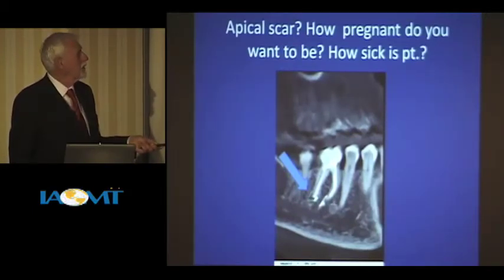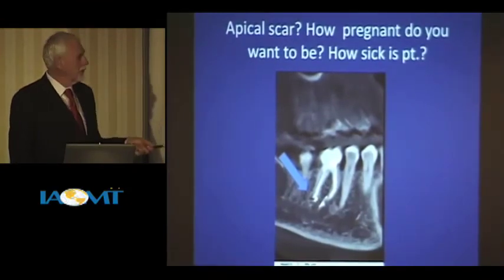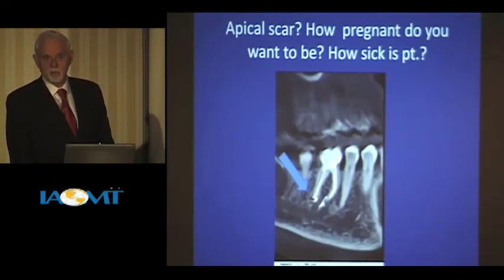Small lesion down here. I was at an advanced course in radiology, and one of the oral surgeons or somebody there, we were looking at CAT scan. He said, "Oh, that's an apical scar. That's not pathology."